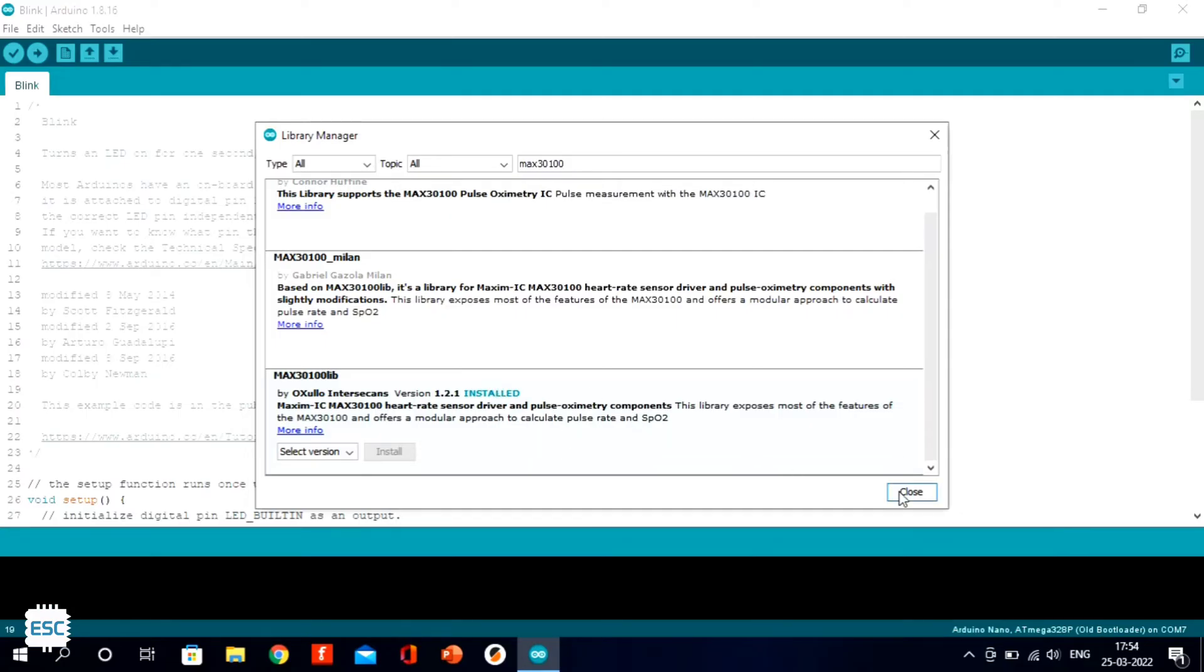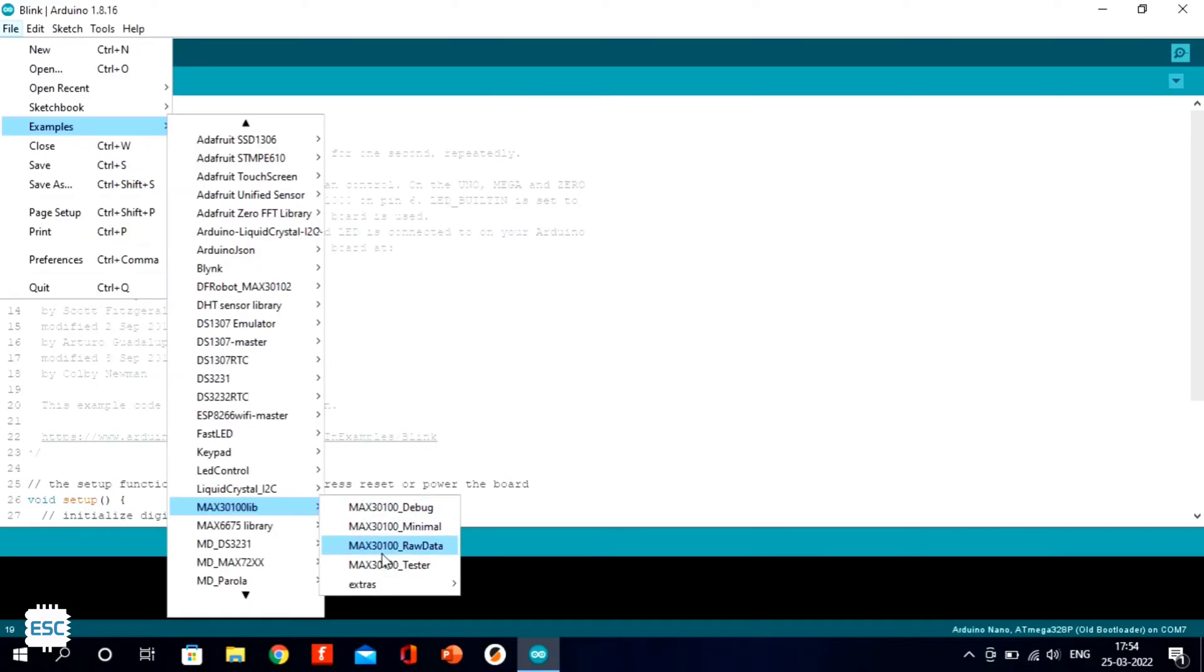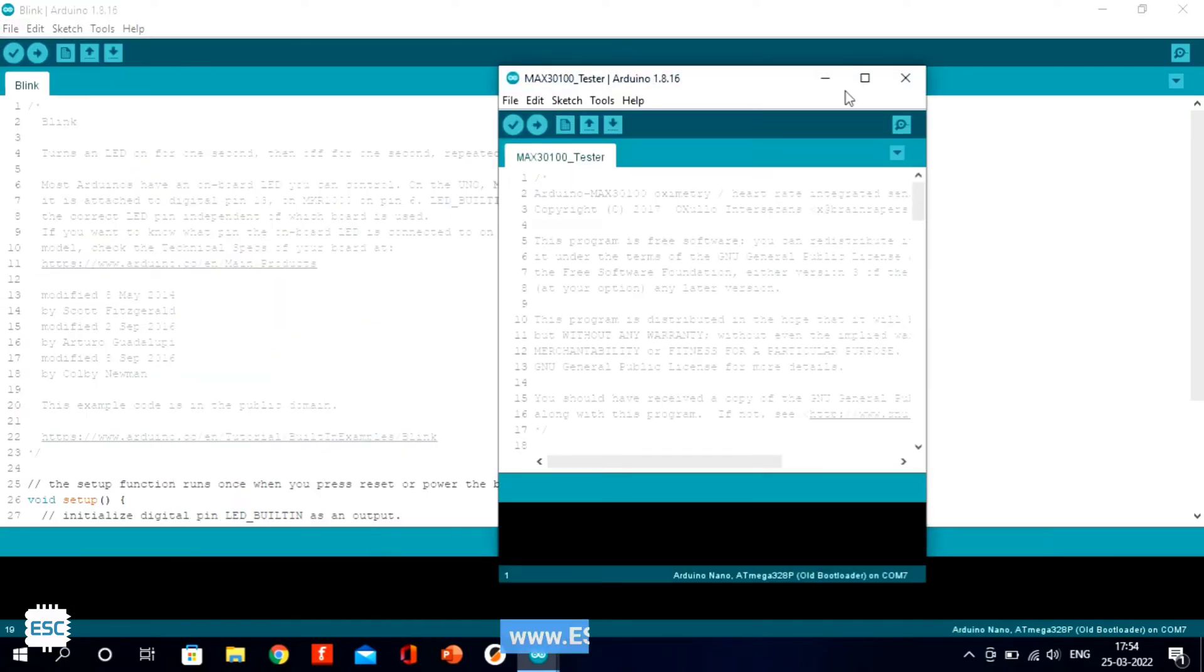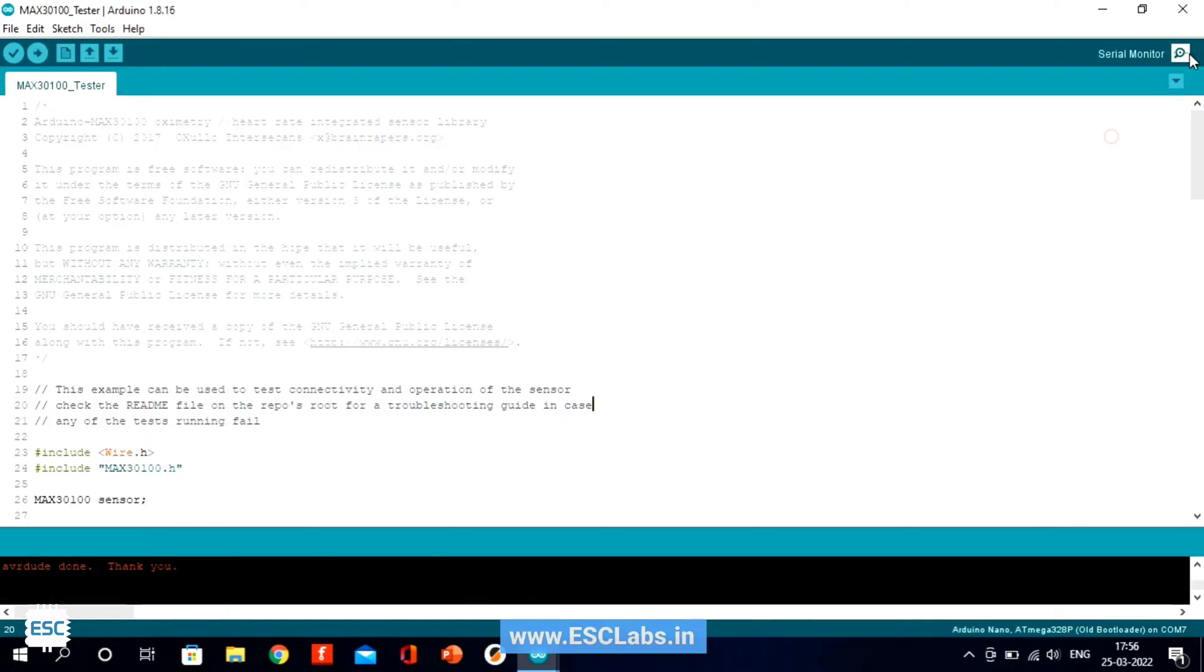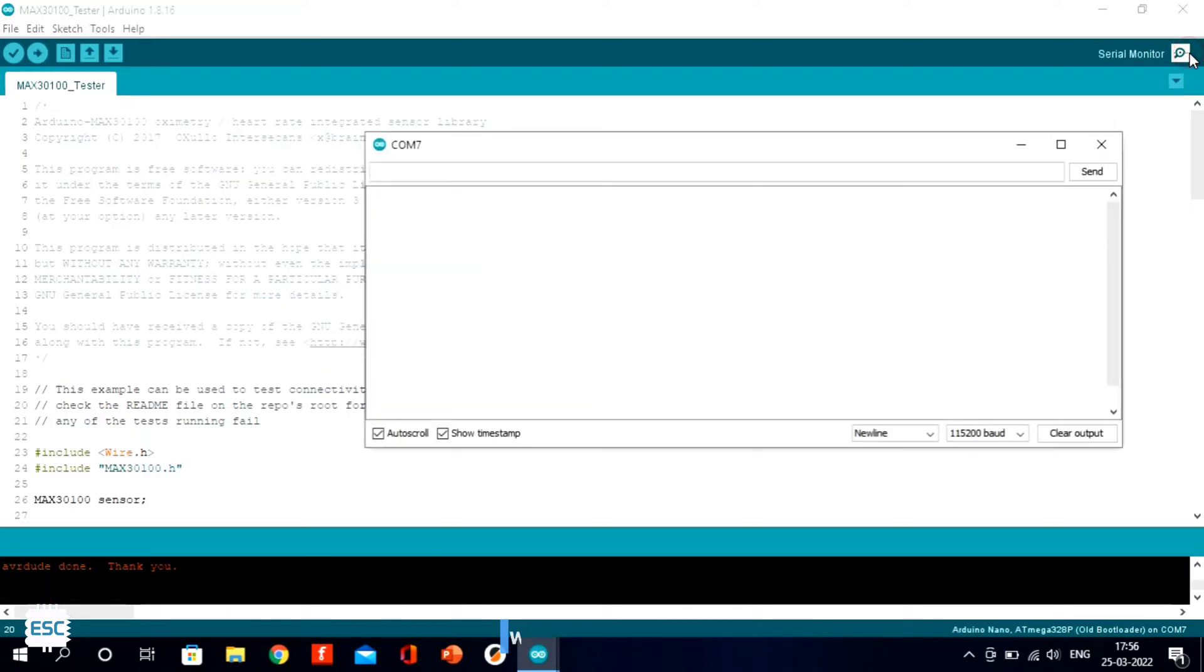Next, I opened the example and uploaded the sketch to Arduino Nano to see what is going on.